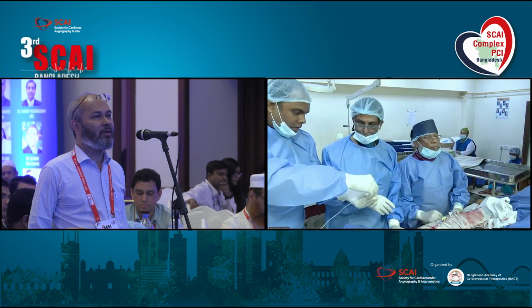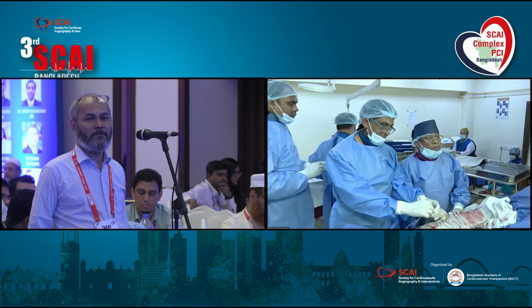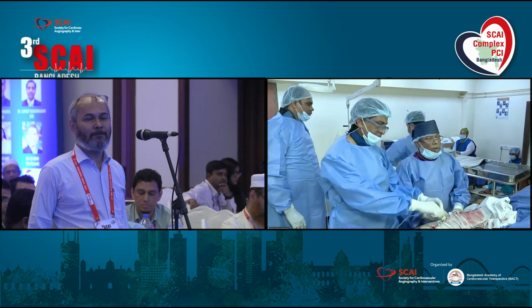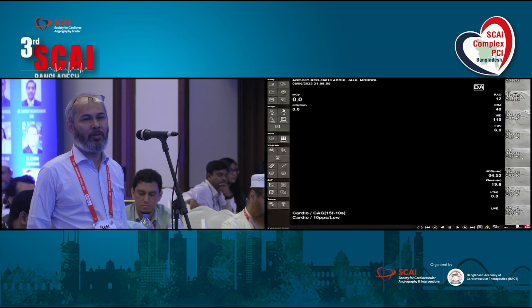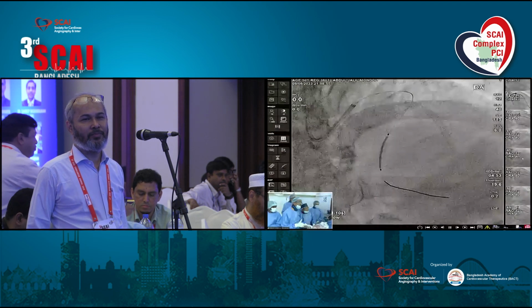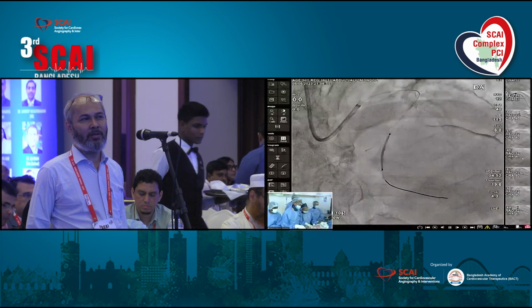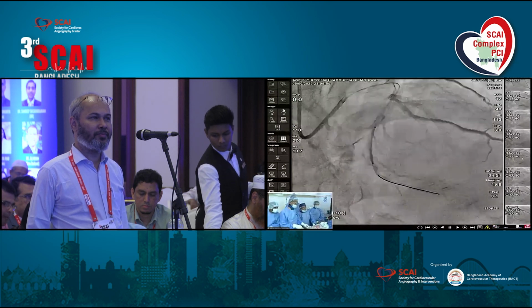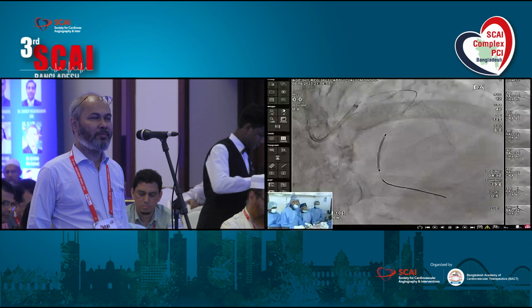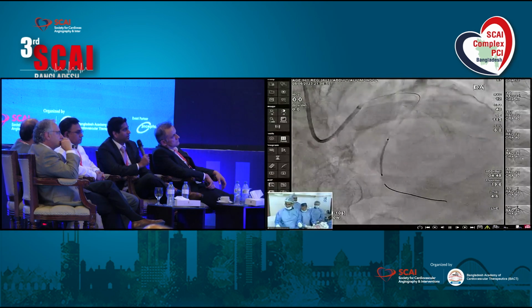The calcified portion? And another thing that is very important, especially for juniors: if you like to do POBA or DCB, you have to keep the balloon inflated at adequate pressure for an adequate period of time. Suppose 12 atmospheres, you should keep the balloon inflated for at least 40 or 60 seconds. That's a good point, because that stops the recoil with an empty balloon.